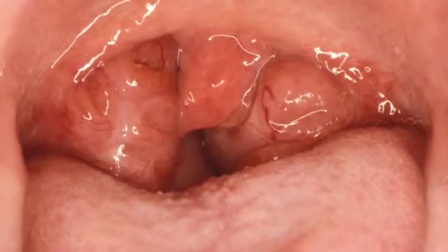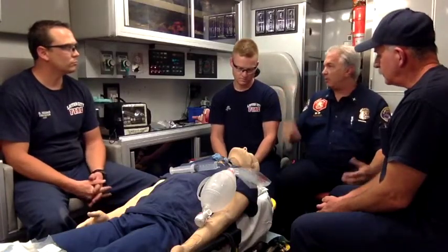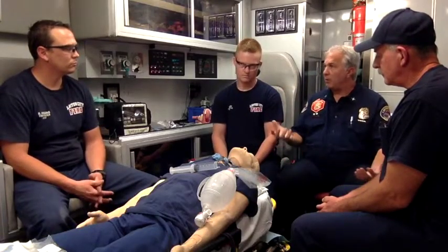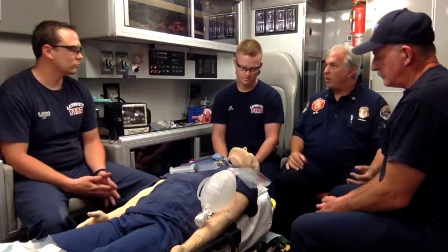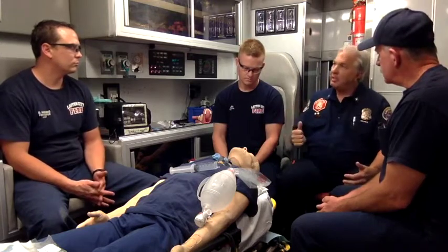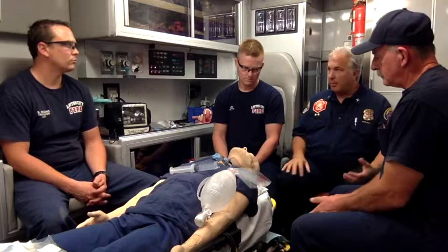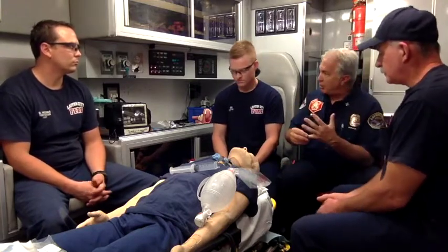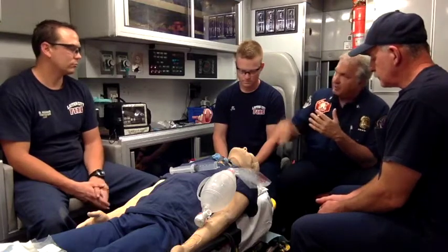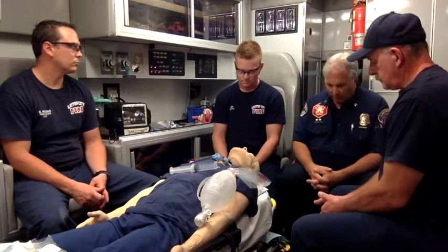So ironically, another good example. Just a couple days ago, the sheriff's office had a gal in a suicide attempt down at the jail that drank a bunch of cleaners, and her airway instantly swelled up. And she would have been a contraindication for that. So they're rare that we would see those things, but if you drop that in just kind of out of routine and habit, and you really notice that you're fighting to bag it, if you can kind of remember RODS, or at least what that's trying to overcome, which is higher pressures, all right, and difficulty of insertion, those are really the 2 things that it boils down to. Those are the things that are kind of our contraindications.